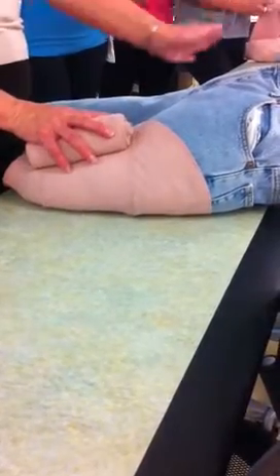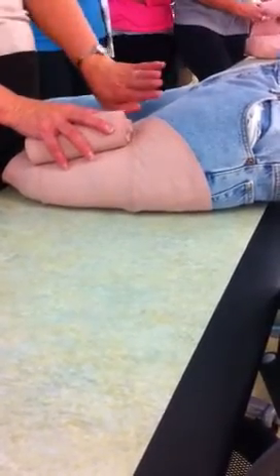If they're unable to help you out with taking things to one side, then you can come in with a towel or sheet or something and say, I'm just going to kind of move things over and tuck as much as you can, so that you're not directly encountering what you don't want to encounter, okay?